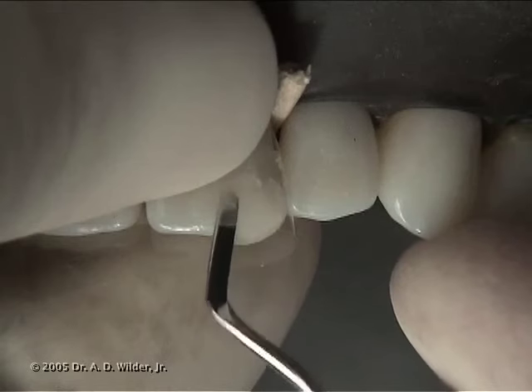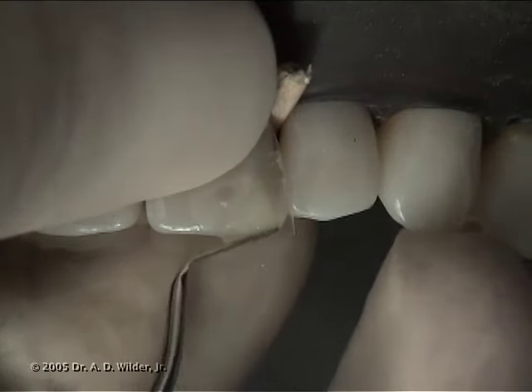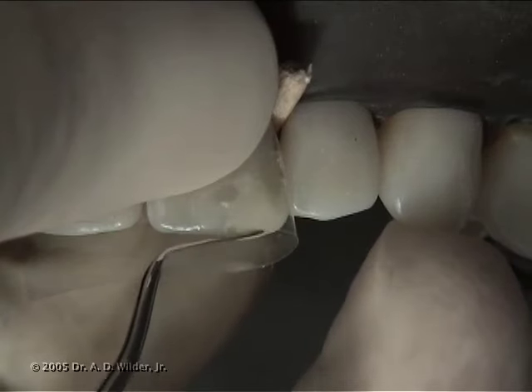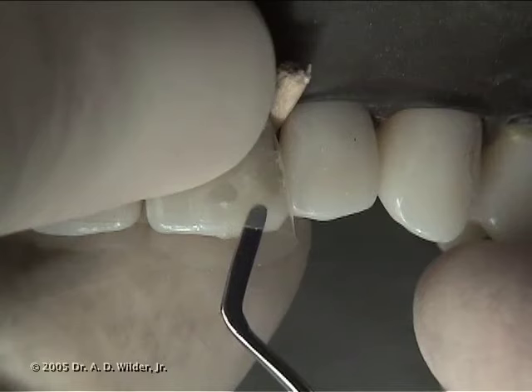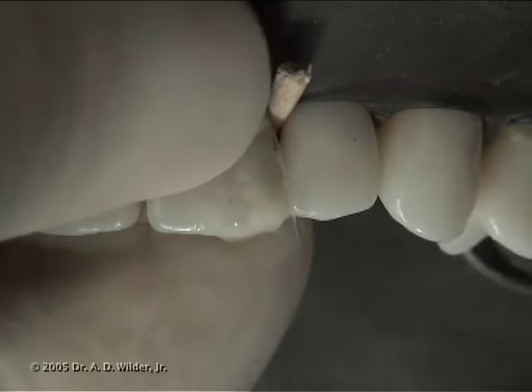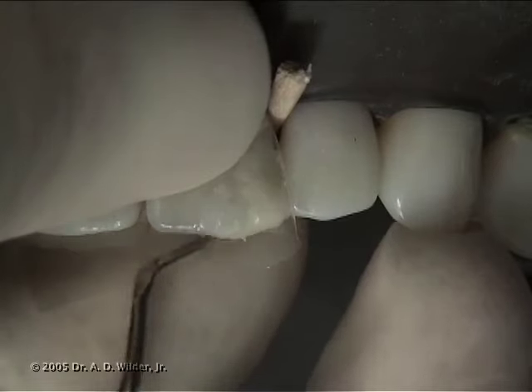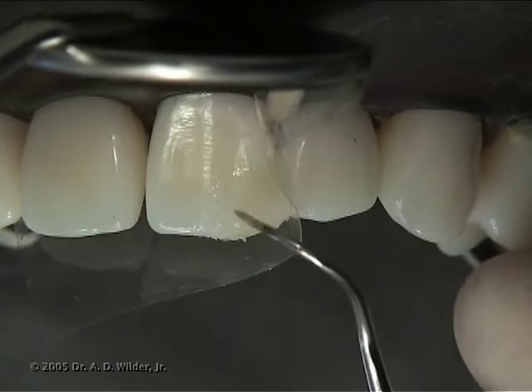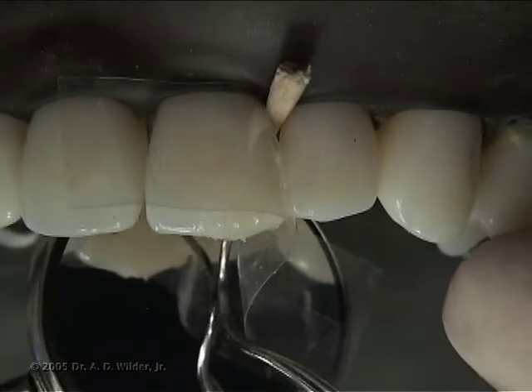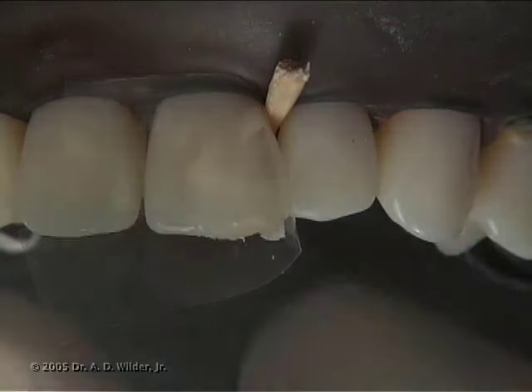It's also good practice to use one of those fingers pushing against the lingual surface to help maintain a proper contour in that lingual area. Be sure to cure from the incisal, facial, and lingual directions as needed. With an explorer, confirm there is no deficiency of material at any of the margins.